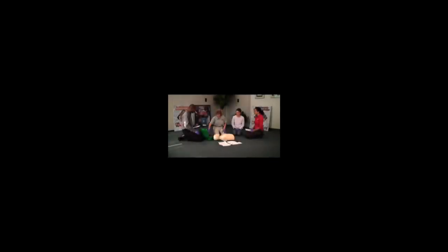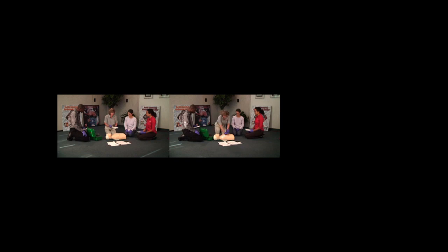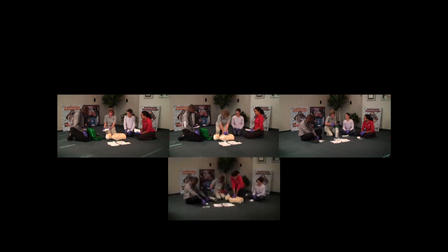Deliver shock now. Shock delivered. And when you open up the pads to put them on, you can see right here, there's a diagram on where the pads need to go.